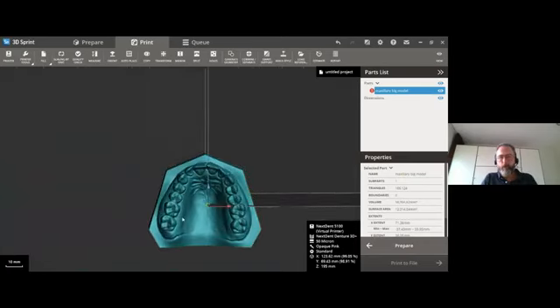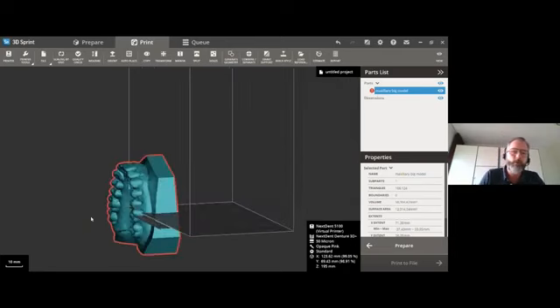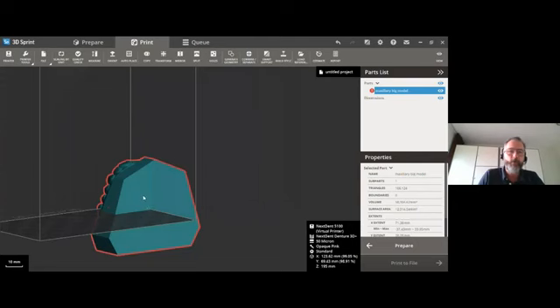That the models are not inside the platform is actually almost always the case, and we are going to hopefully change this. In order to do so, we need some information in the STL files. This is why we work with the CAD software companies, the dental design companies, because then they can say to us, or we should say to them, that this is the orientation that we want.